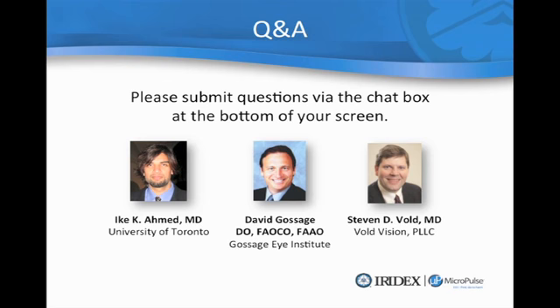Now, the other thing I have been doing a little bit lately is actually increasing the power just a little bit more. So I may even go up to 400 to 500 milliwatts of power. I still feel very comfortable as I shoot a fluorescein afterwards. You're not really seeing any changes in the retinal architecture at all at that point. But remember that you have to use that 5% duty cycle. And like I said, it is very foveal friendly.